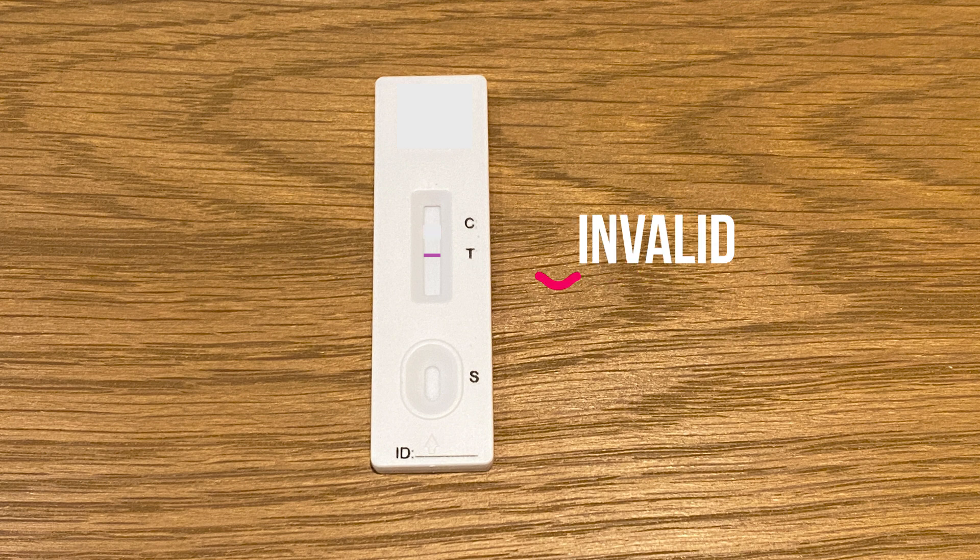If you have a single line only where the test is but the control line is blank, this indicates the test is invalid and you would need to repeat it.